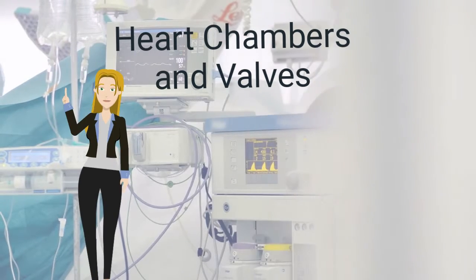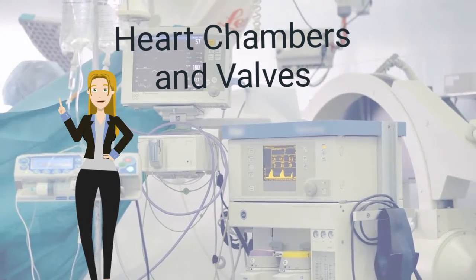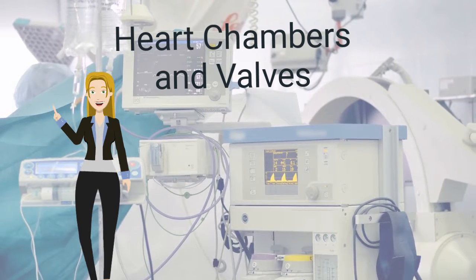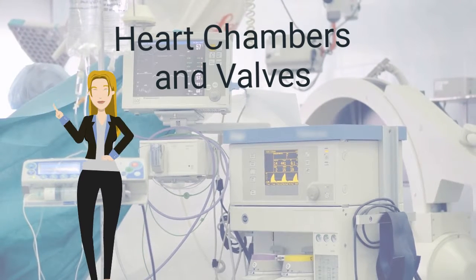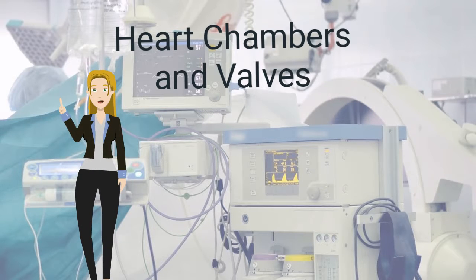Sometimes a cardiac catheterization is done without coronary angiography. Your cardiologist will take measurements of different pressures in different chambers of the heart and look for problems within the heart chambers and valves. These measurements provide valuable information about how your heart is functioning and provide data that aids in the diagnosis of different heart conditions.